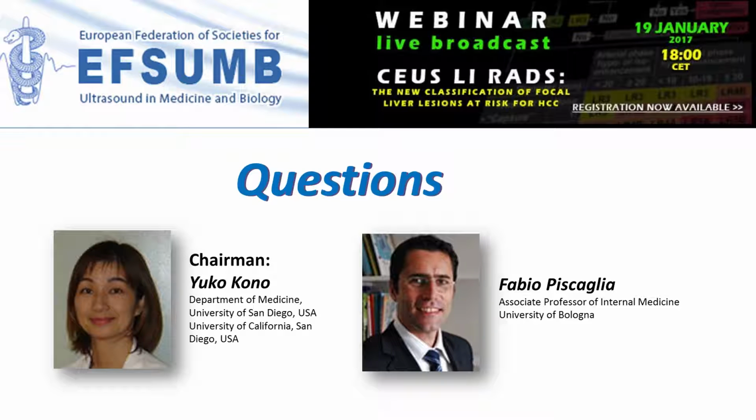Yeah, just a very brief comment to the question before. The amount of sulfur hexafluoride to be injected is between 1 and 2.4 milliliters, depending on the sensitivity of the equipment and not on the degree of liver failure. The only situation when I would recommend the lower dose is when you have no portal inflow, like in portal thrombosis or reversal of portal flow or TIPS, because you have no portal flow in the parenchyma, you only have arterial perfusion. Then to separate neoangiogenesis from the background parenchyma, you have a shorter time, and I suggest to inject a lower dose.